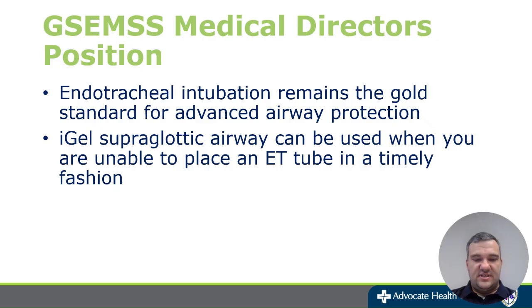I-gel can be used, however. We're not saying you can't use it. It definitely is a good device in a lot of situations. There are a variety of reasons where you may choose to use an I-gel first of all. And this would be A, if you can't place an ET tube, you can move on to an I-gel as a kind of a backup device.